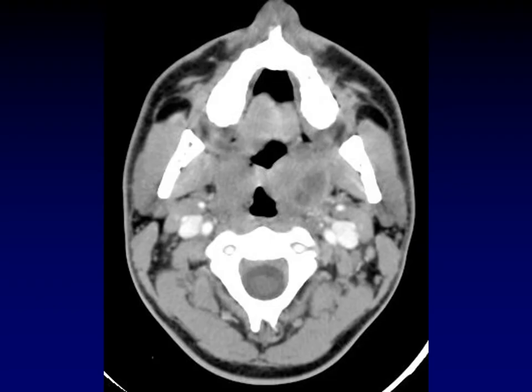The first thing to consider in the lateral pharyngeal space is infection. Here is the classic appearance: a mass with predominantly low density centrally and a rim of enhancement. Look what it's doing to the parapharyngeal fat — it's pushing it out laterally, maybe a little bit posteriorly. Notice its relationship to the palatine tonsil: it is deep to that tonsil, between the tonsil and the parapharyngeal fat. This is the peritonsillar space, and this is where peritonsillar abscesses arise.